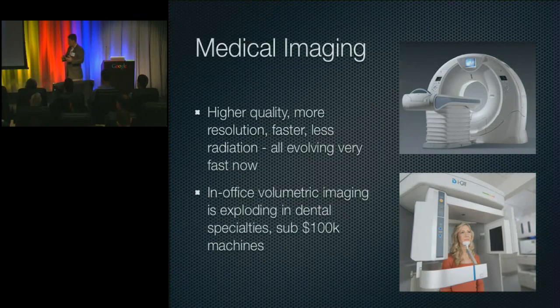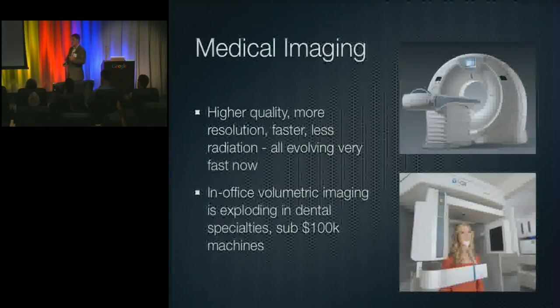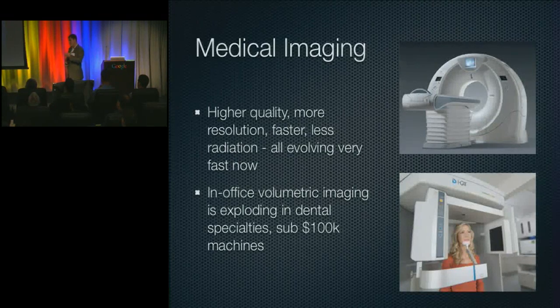The other big push is in dental imaging. I don't know how many of you have been to the dentist lately, but more and more they're starting to implement in-office scanners like this one, which is basically an in-office CT scanner. Much like you'd traditionally go to the hospital, lay down on a couch and get shoved in and out of a regular CT, you go to the dentist's office, and in a 20-second acquisition they image your whole head, all your teeth, the bone and the soft tissue.